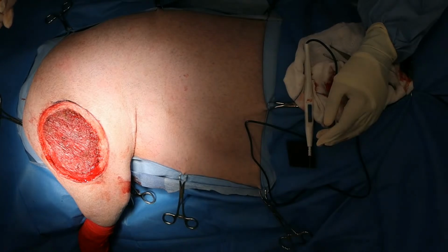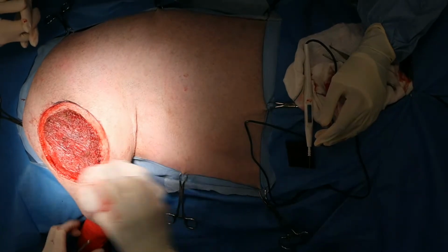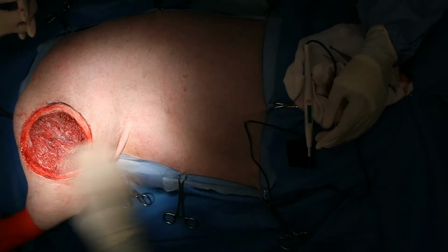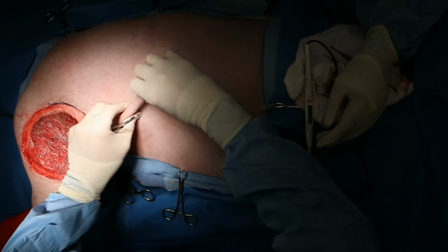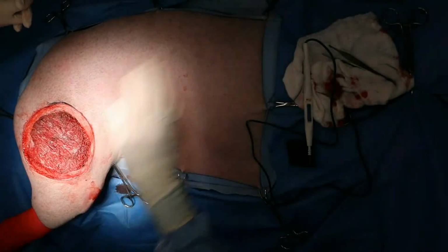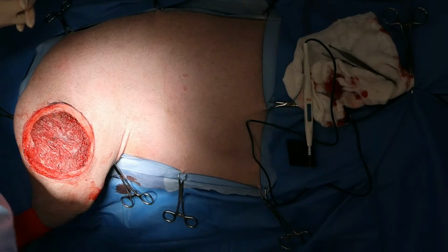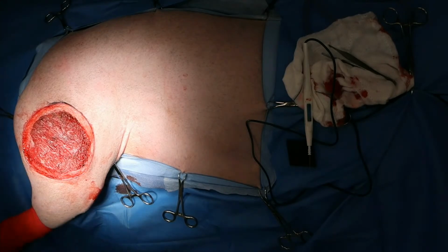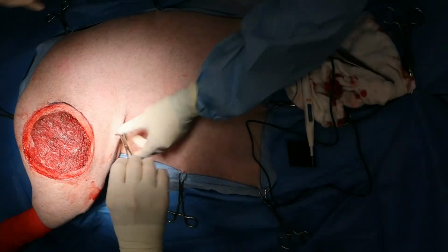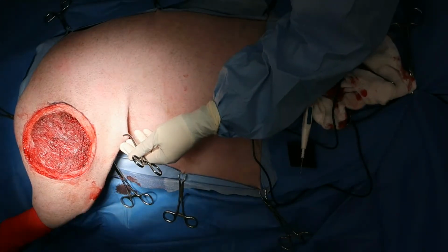So there's a question about do I really need the local if I've done the epidural? Look, probably not, but it's not going to hurt anything. And I'm just really concerned. I just want to make sure that we've covered all our bases as far as pain relief is concerned. So I'd rather have a little bit of overkill, because I would imagine this would be pretty sore.